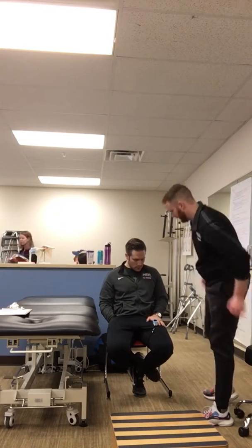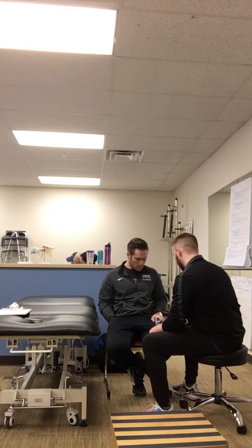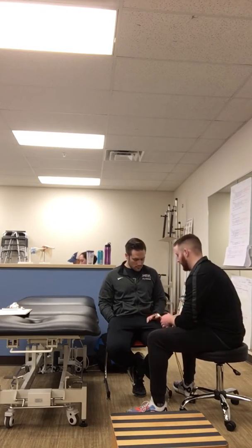So this device, like I said, will show you a heart rate and an oxygen. Press the button, get it towards me. So 95 oxygen, 94, 91 heart rate. And then also for rest, you evaluate the fingernail, making sure the color comes back to normal after pressing. If you see any blue coloring, it means lack of oxygen. So it's just something to monitor.